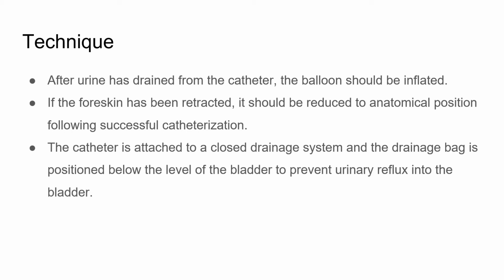While inserting, the urine can be seen draining out. At that particular point, the balloon should be inflated. So 20 to 30 cc of sterile water has to be injected and it has to be inflated. If the foreskin has been retracted, it should be reduced to its anatomical position. So it should be made normal, if at all the skin was retracted first.